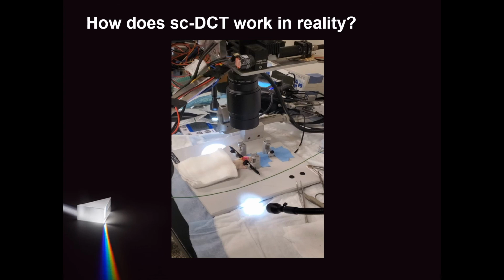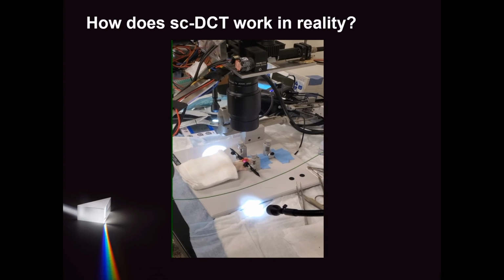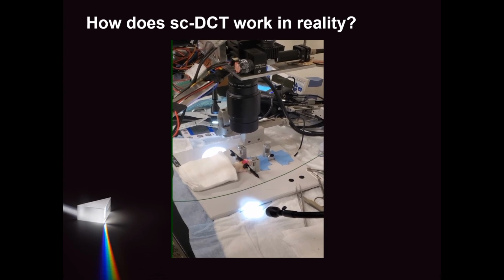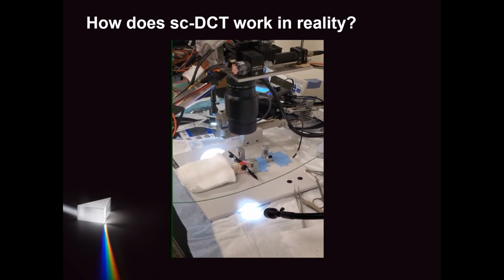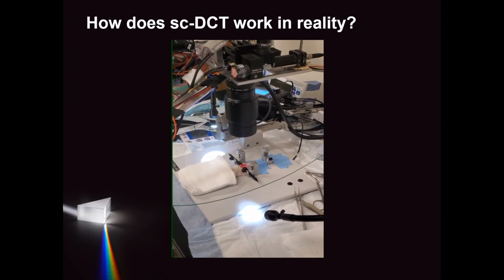And here we are going to show you a video in order to have a better understanding of SC-DCT and how it works. You can see in this video that the light source is scanning the rat head by the galvanometer.